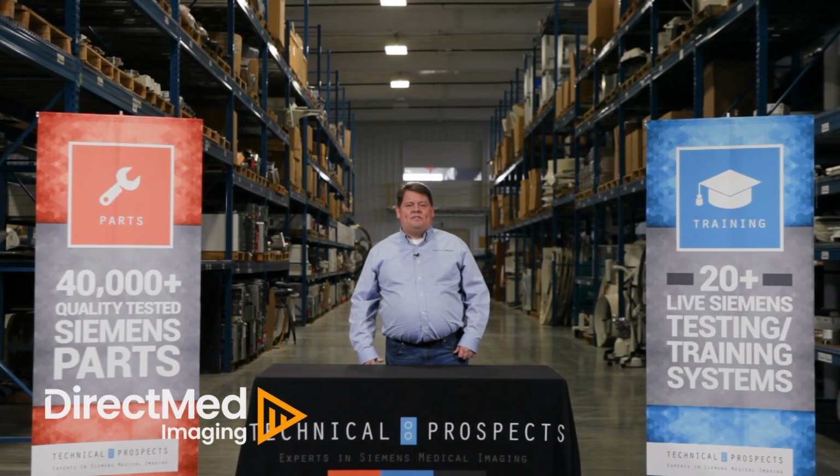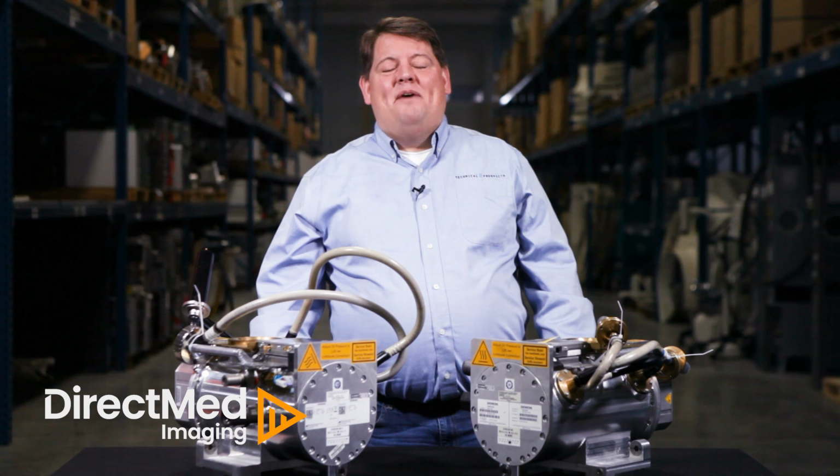I'm here today to talk to you about some helpful tips and tricks in regards to your Siemens medical imaging needs. I'm here today to talk to you about how to properly identify a tube for the Definition family of CT systems. I've got two great examples, and we're going to go through what to look for so you can get the right tube right away.